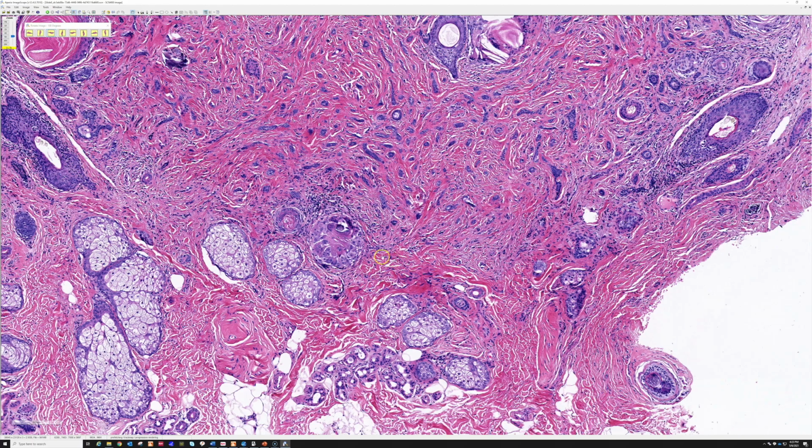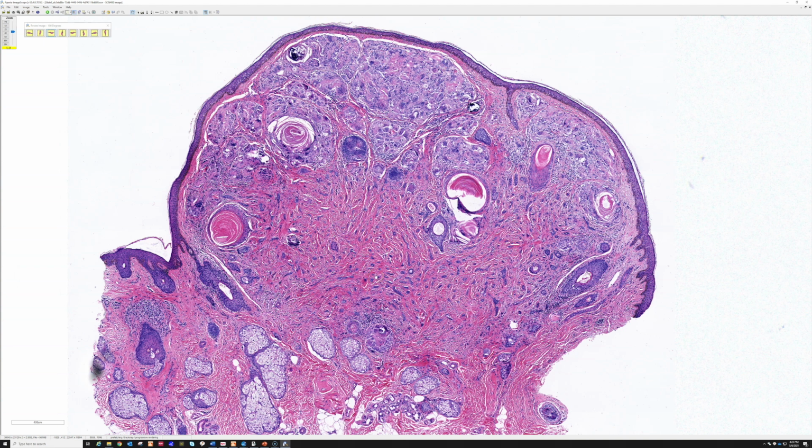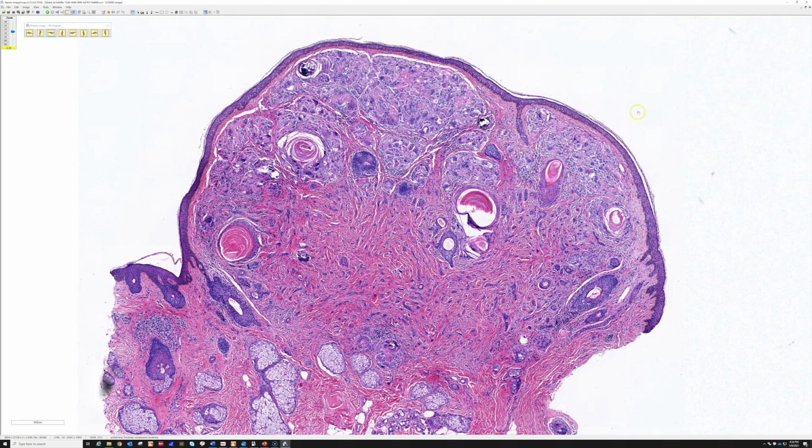All right, so a nice example of desmoplastic trichoepithelioma. I don't have another example of regular trichoepithelioma in here, but if you've ever seen one of those, it looks totally different from desmoplastic trichoep. And in fact, I think that they are probably 2 different tumors that are both hair follicle tumors, but otherwise not really related, because in my experience, they don't usually have areas that look like regular trichoep. They just look like their own thing. So that's my thought, but I'm sure that there are other people more educated than me that have different views, because there's nothing that dermpaths love to argue about more than adnexal tumors. So it's funny because it's true. All right.